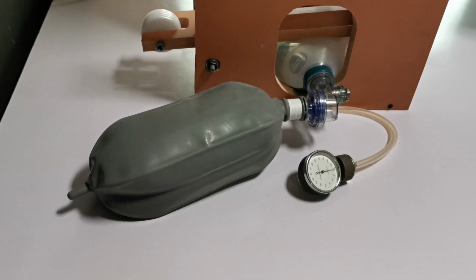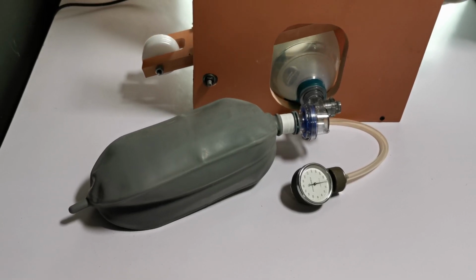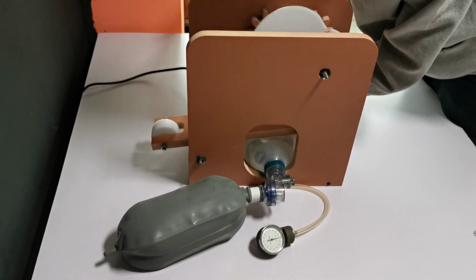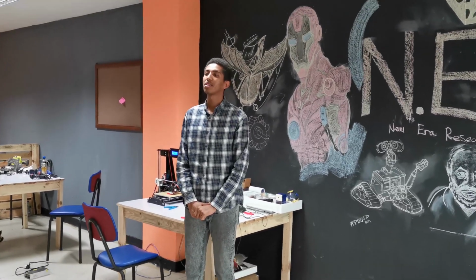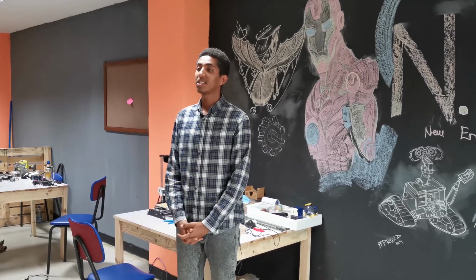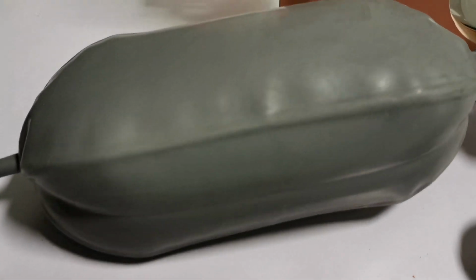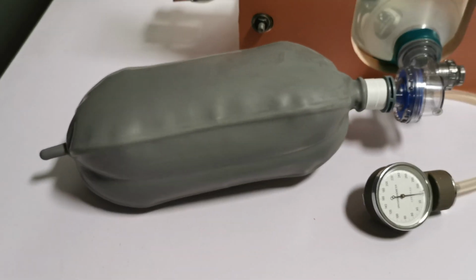A ventilator is a mechanical device that moves breathable air into and out of a human lung. This is very useful for patients who are partially or fully unable to breathe. During this period when the pandemic is expanding, we're going to need more ventilators. This is because the coronavirus affects the human lung tissues, which makes it hard for a patient to breathe properly.